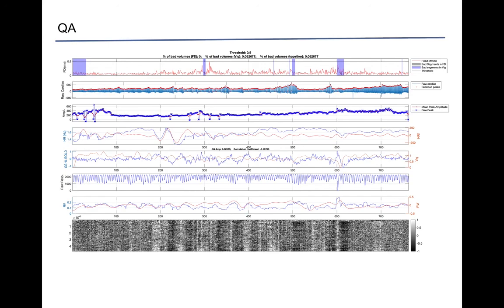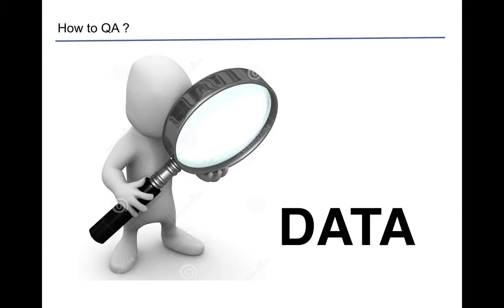Those red dots indicate the peaks of the waveform, meaning that the algorithm failed in detecting the right peaks. So in this case, maybe you have to go back and double check your parameters for that algorithm. If it's possible, fix it, but if it's not, then you may just skip using that cardiac waveform in your model.